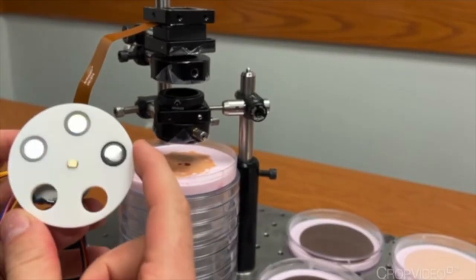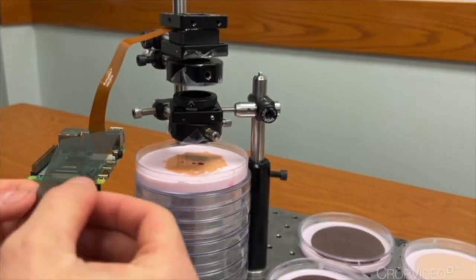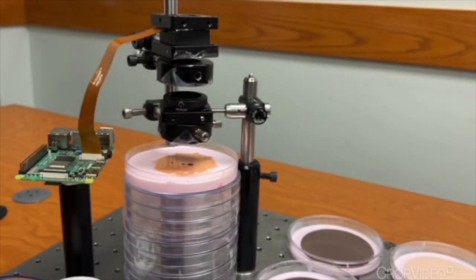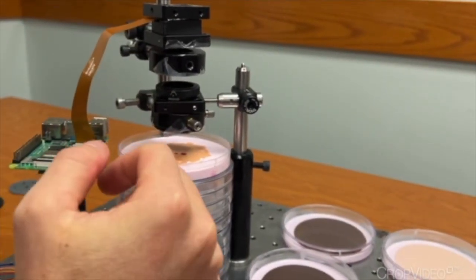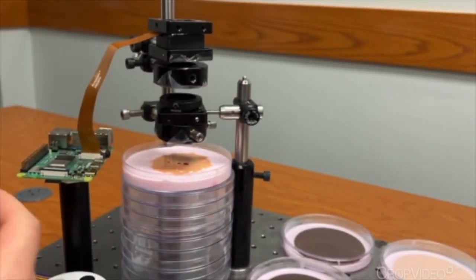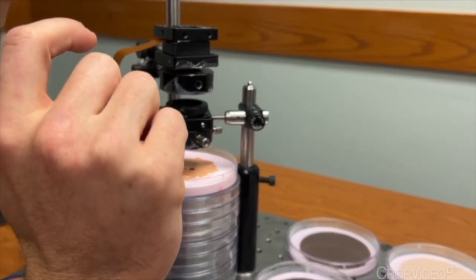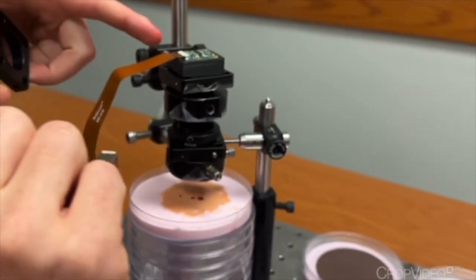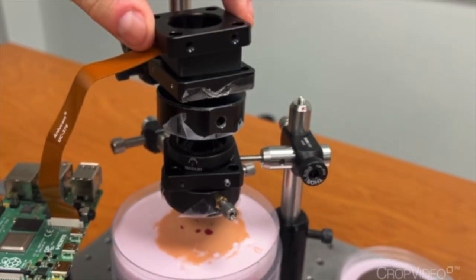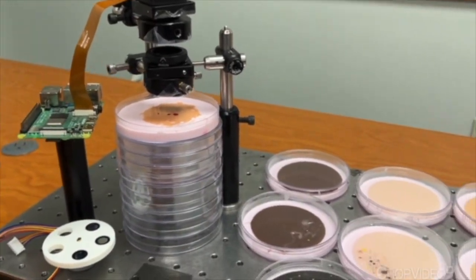To go over some other components that we're going to have in here, in between this section is going to be our filter wheel with 3 filters that are going to iterate in order to allow us to take multiple images. We have a linear polarizer that we're going to have here that's going to rotate, allowing us to change the polarization of the light we want to capture. And then we also have an iris right here to be able to change the depth of field for our images. And then lastly, we have up here our camera module, which is a Sony IMX219, which we use to do all the magic. And yeah, that's pretty much it. Raspberry Pi, and then I'm going to pass it off to Tatiana.